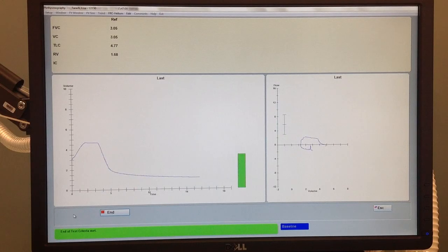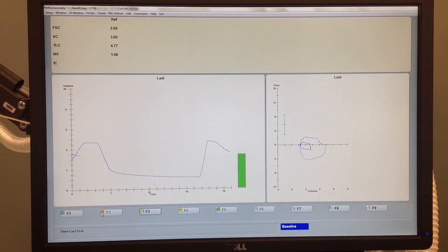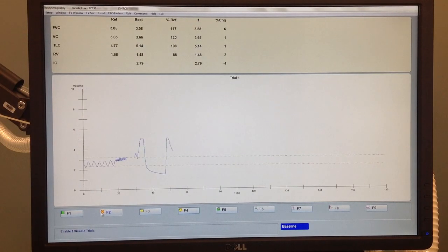Okay, big breath in. And end test. Okay, take your mouth off. All right, no error messages.